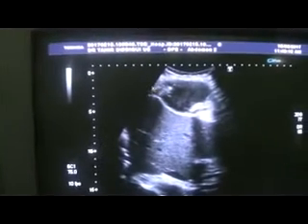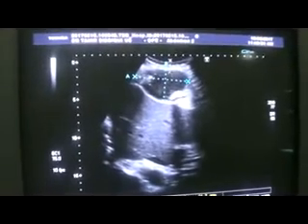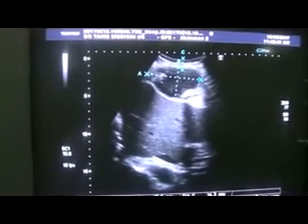65-year-old female. What you are seeing is a loculated fluid collection full of internal echoes along with calcification. This calcification here and a few others. It measures approximately 7.2 centimeters by 4.2 centimeters and it is only 16.3 mm deep to the skin.